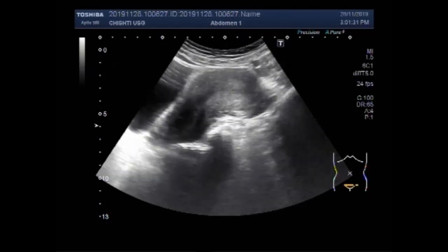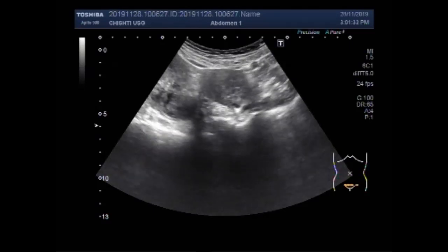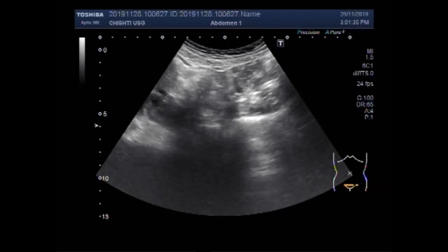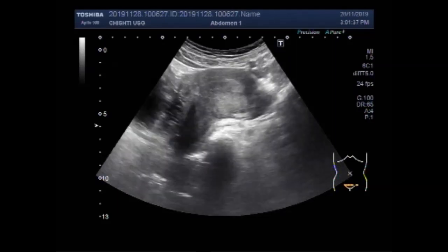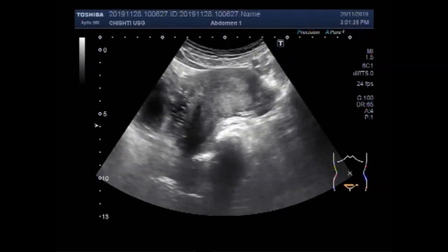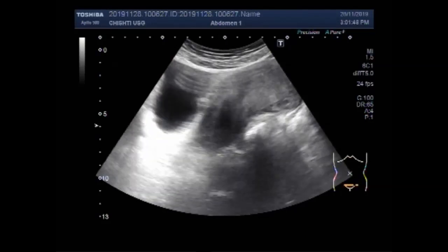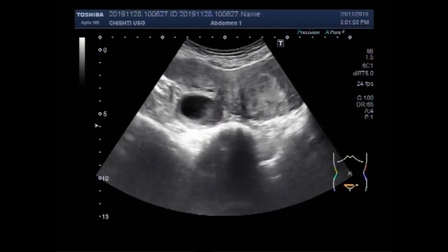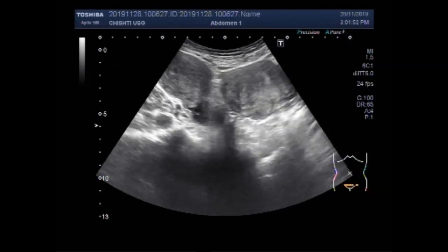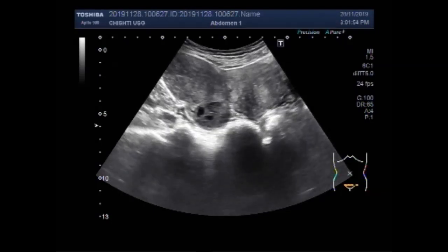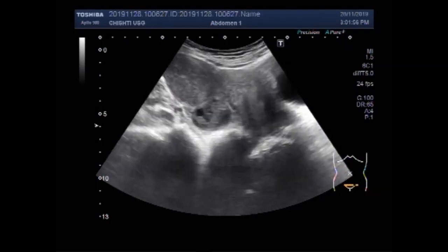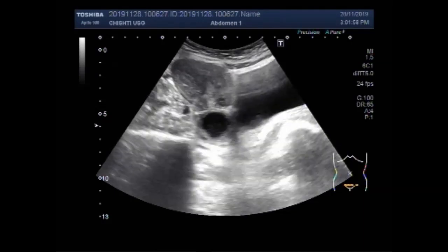Again you are going to see the fibroid, cervical cyst, and a small left ovarian cyst. This is the right ovary, and this one is a cyst in the left ovary.